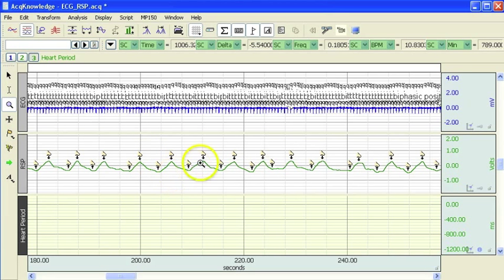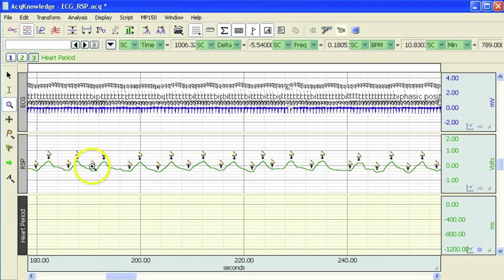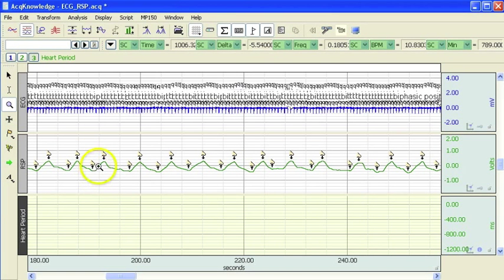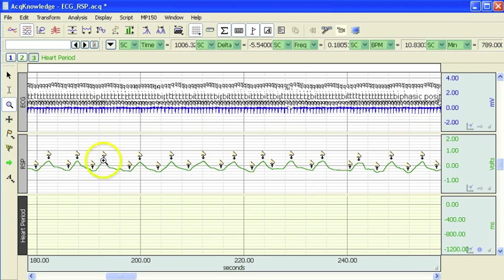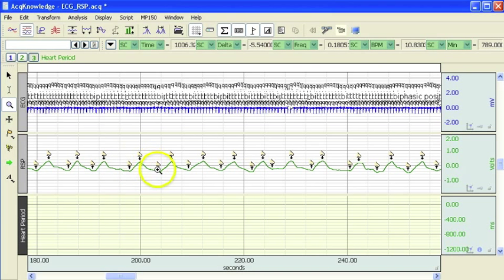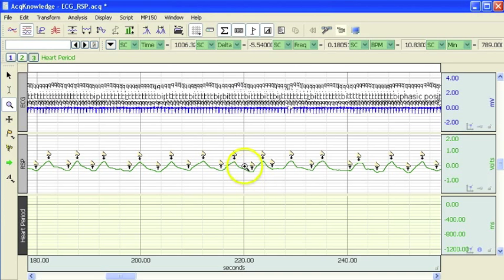This is the respiration signal. The nose with the arrow is marking the beginning of an inspiration and the downward arrow coming out of the nose is marking an expiration. So you can see each of these points is marked in the recording.